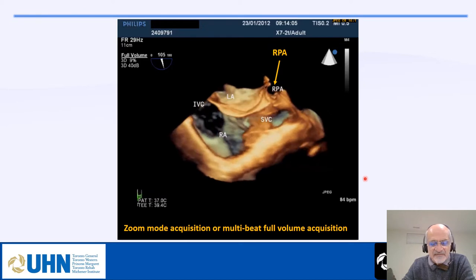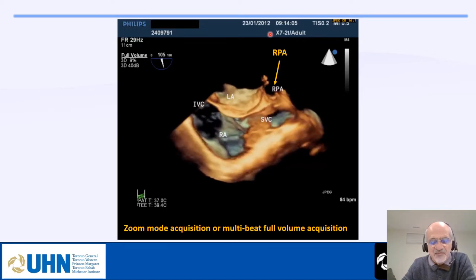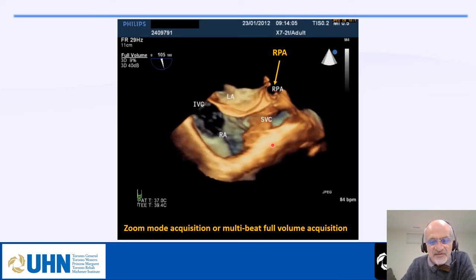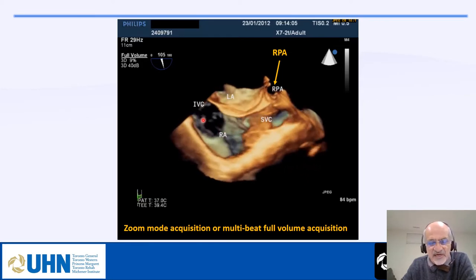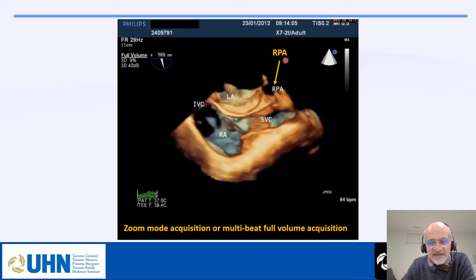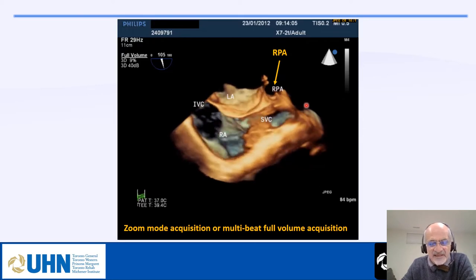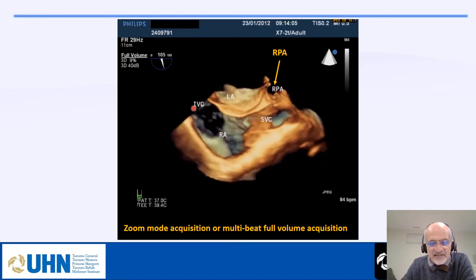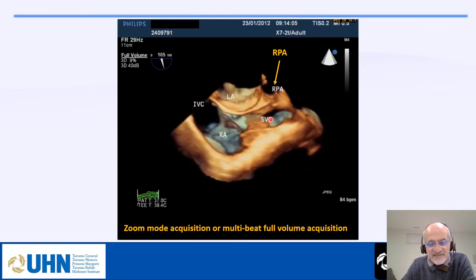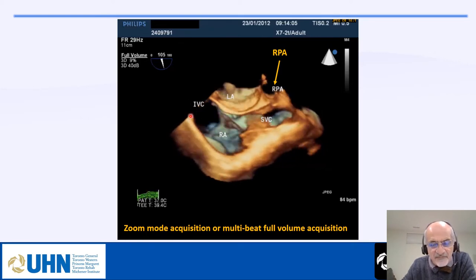This is either a zoom acquisition or full volume — this is a full volume from 2012. You can see the SVC, the right atrium, the tricuspid valve, part of the IVC, the left atrium, and the right pulmonary artery. It is very important to note that the SVC and IVC are not in exactly the same plane — the SVC is more anterior and the IVC is more posterior.